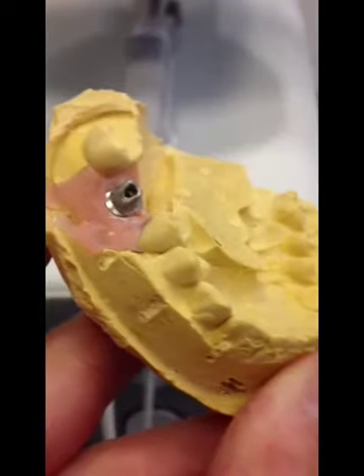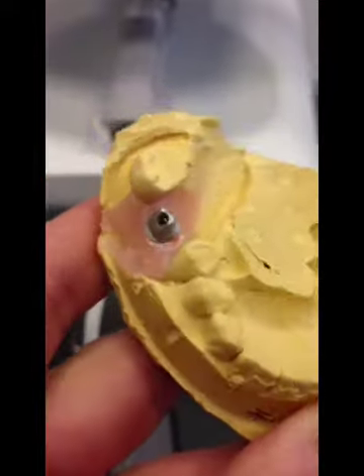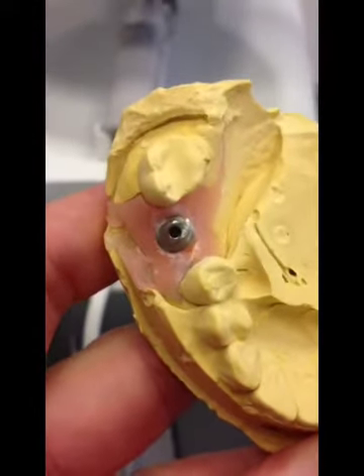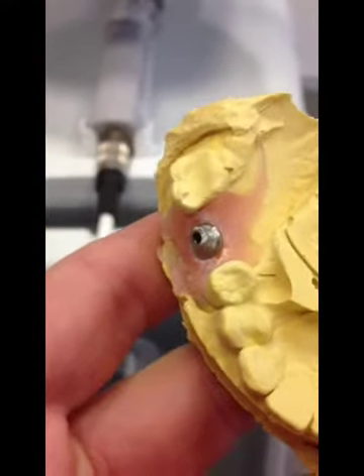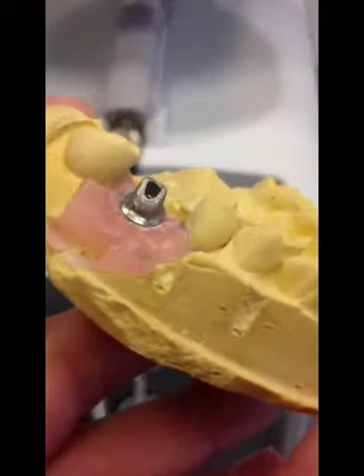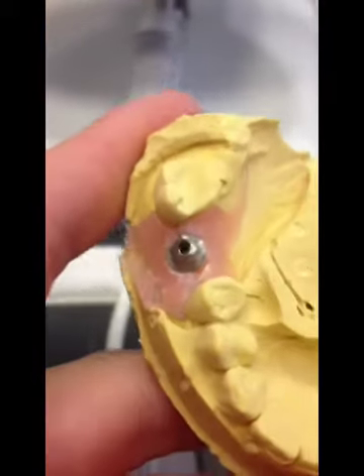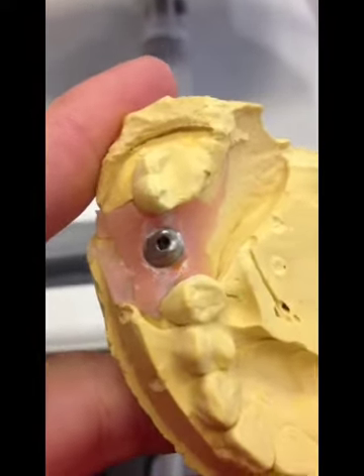So what I'm going to show you here, we've got the implant abutment set up, and obviously I'm not going to tell you how to get to this point. If you need to know how to get this port up and the analog and how to shape the abutment and everything, take a class on it. And so I'm just going to start at this point here.